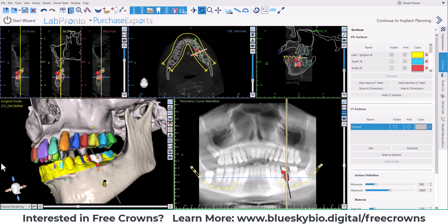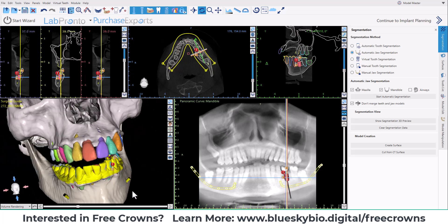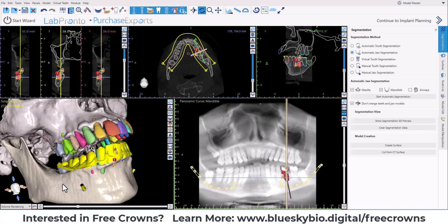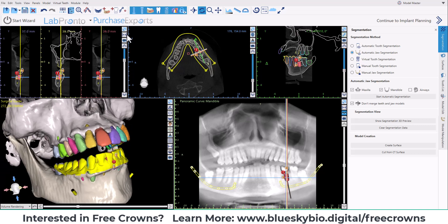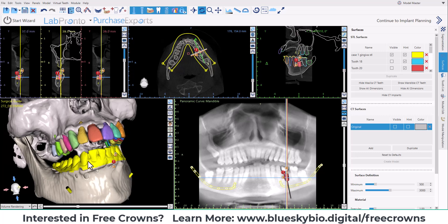In this dataset, I have run the automatic segmentation from the segmentation panel. I run it in pretty much every case because the functionality is great for patient education and implant planning. Before extracting a tooth from the model scan, if you did run the segmentation, you should hide the segmented teeth. I'm switching over to the surfaces panel and hiding the mandible CT teeth, as I will be extracting a tooth from the optical scan on the mandible.